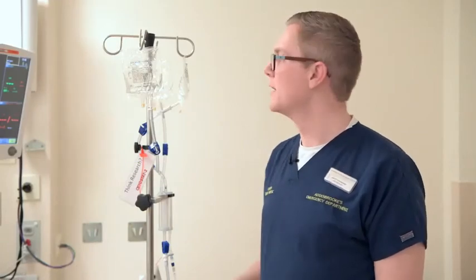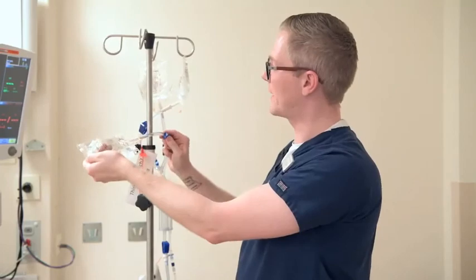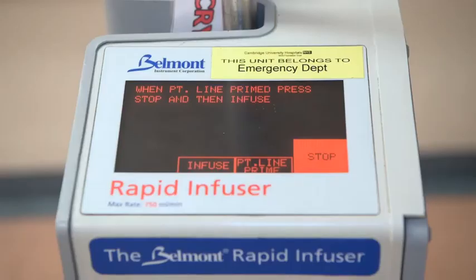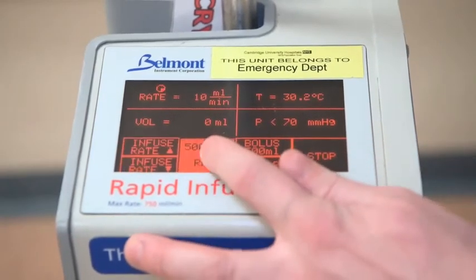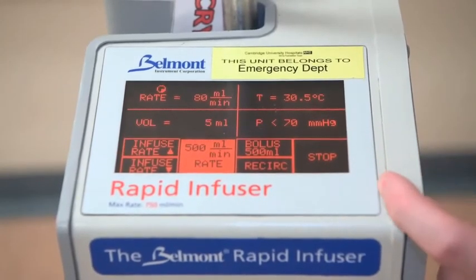Now the Belmont is primed and we're ready to transfuse blood products. You need to disconnect the bag from the spike after clamping off, then reconnect with your blood products, hanging the blood products and making sure you're unclamping, and just press infuse. When you press infuse, you'll get a second screen that comes up. Just press the 500ml per minute button, and that will start infusing at 500ml a minute, or as close as it can get.